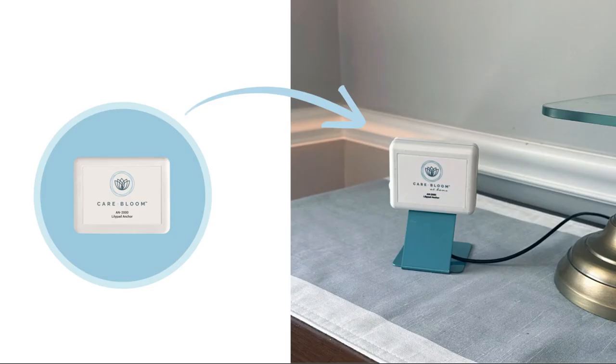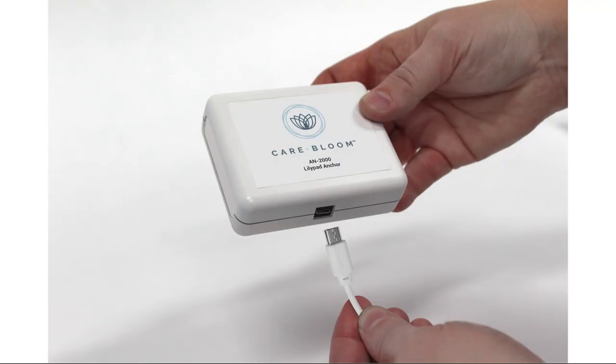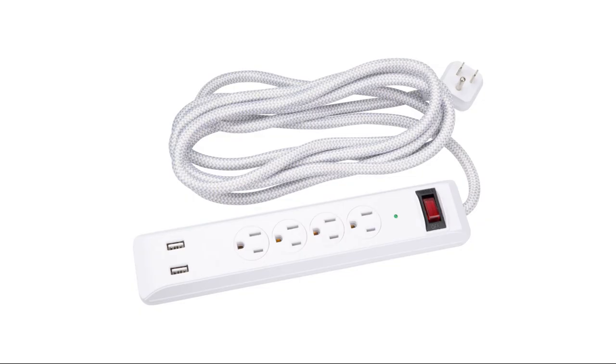Anchors can be installed on tabletops or can be placed on the wall. It's important that it's not blocked by furniture or tabletop items. Anchors are plugged into electrical outlets, so you may need extension cords if yours are sparsely placed.